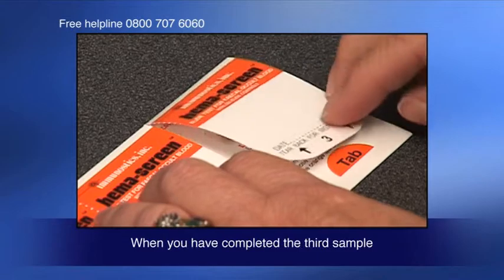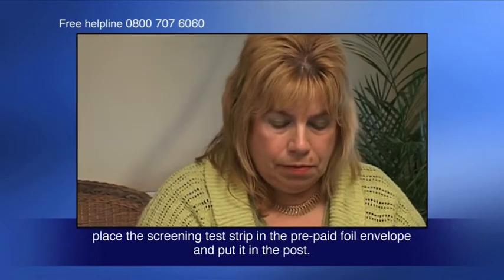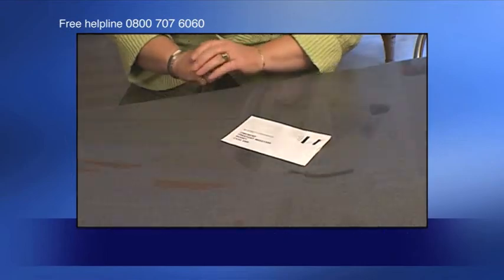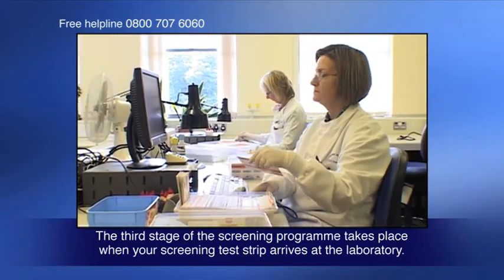When you have completed the third sample, place the screening test strip in the prepaid foil envelope and post it. The third stage of the screening program takes place when your screening test strip arrives at the laboratory.